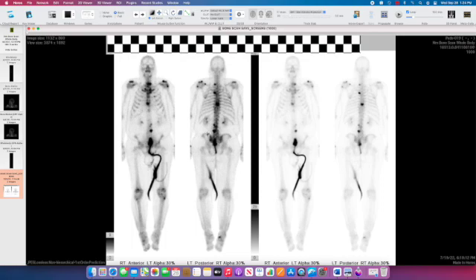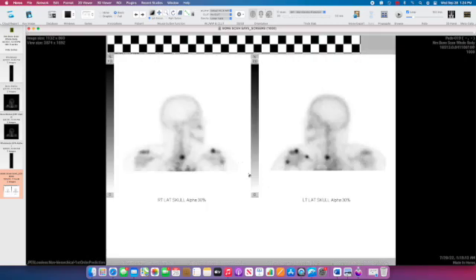These are the same images here and here, just windowed slightly differently, and if you scroll down to the next page, any spot views that they've done will appear here. One standard view is a lateral image of the skull.